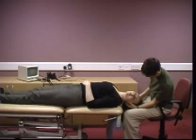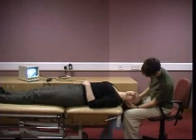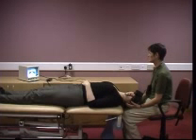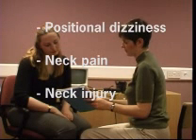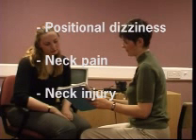This tests for benign positional vertigo. It can be done by direct observation of eye movement or by using video goggles with or without primary fixation. The test should be described fully and carried out with care, particularly with patients who have a history of positional dizziness, neck pain or neck injury. The procedure can be amended if necessary.